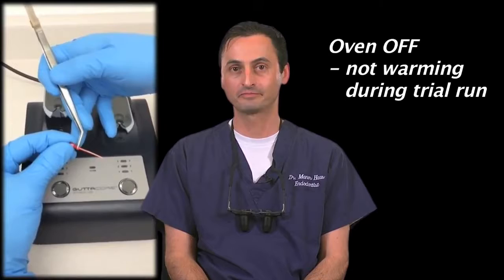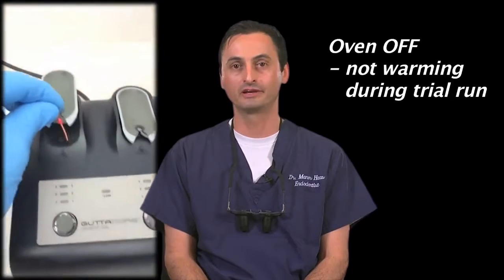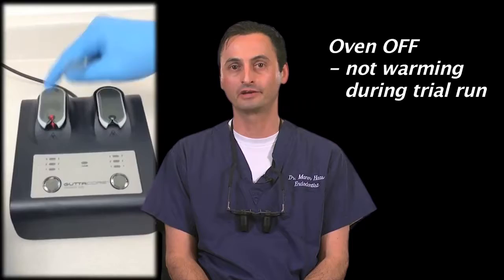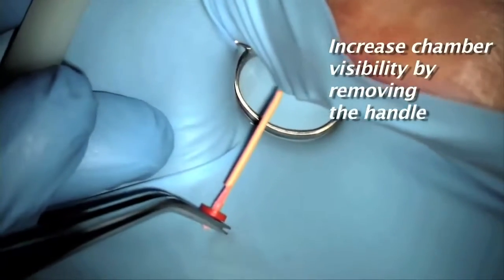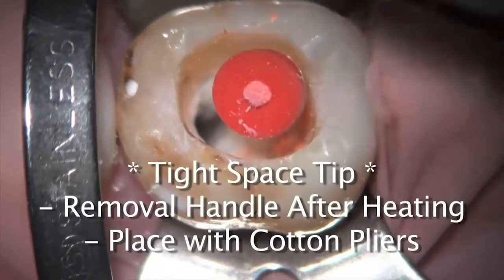If you're new to using GuttaCore, I strongly recommend that prior to warming the GuttaCore, you practice the placement of a GuttaCore into the oven and its removal from the oven. This video shows a trial run with the oven off. Place the rubber stopper to your working length as per the markers on the GuttaCore, place the GuttaCore into the oven's GuttaCore holder, and press down. To remove the GuttaCore from the oven, press down on the holder, and with one hand grab the GuttaCore handle, and with cotton pliers in the other hand, grab the GuttaCore just above the rubber stopper, break off the handle, and now you're ready to carry this GuttaCore obturator into the canal. The ability to break off the GuttaCore handle and turn the obturator into a shorter and easily maneuverable GuttaPercha separates this from other warm obturation systems on the market.